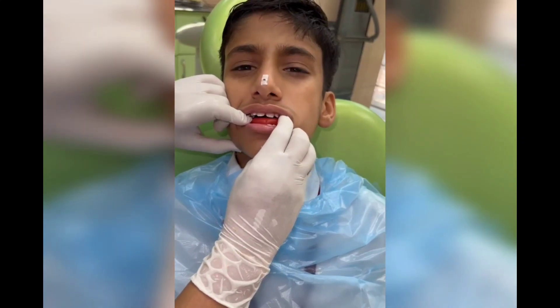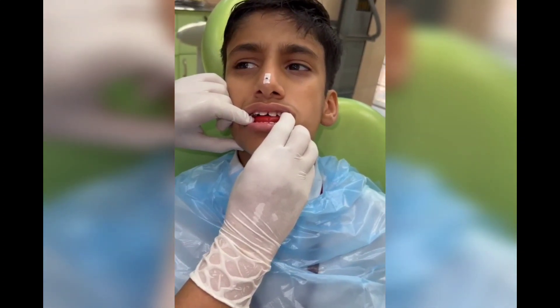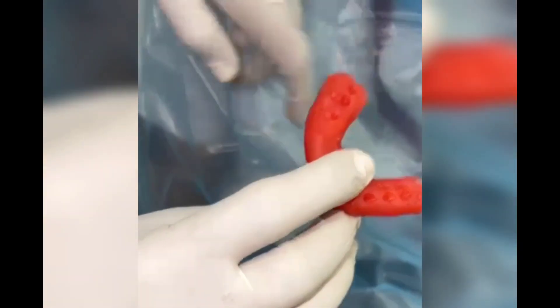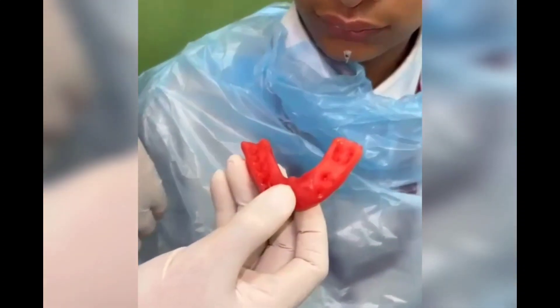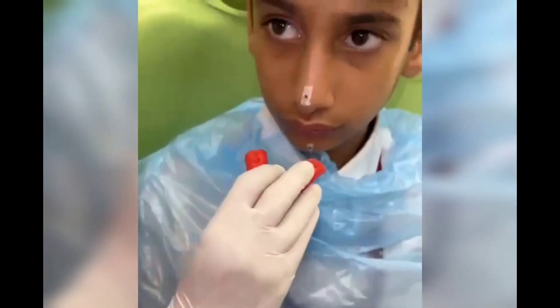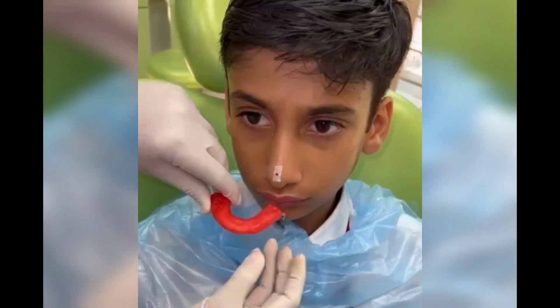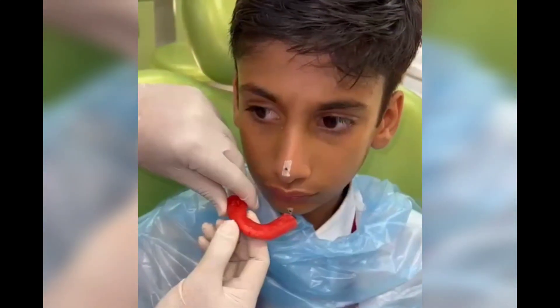Guide the patient to close gradually at the desired position — close, close further, until that's it. You can place the bite either on the lower arch or on the upper arch as per your convenience, but because of gravity we usually prefer putting the bite on the lower arch and guiding the mandible to the desired position.